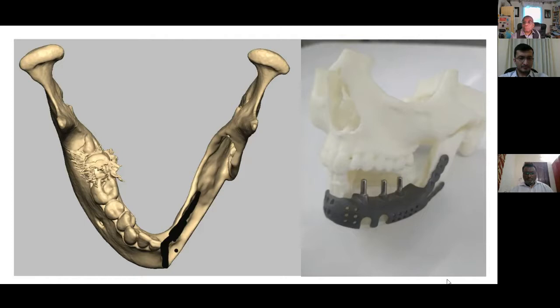And the beauty of this case compared to the previous segmental resection is the new bone. There's a new bone bridging from one side of the cancellous bone to the other side, the ramus cancellous bone, along that hollowness. And the cross section of this process is C-shaped. Unlike the tubular process in the previous case, this is a C-shaped process, so the C-shape is cuffing onto the lingual osteoperiosteal flap.